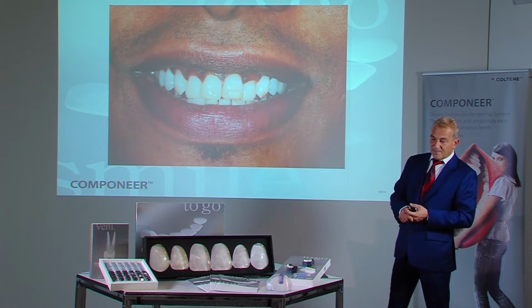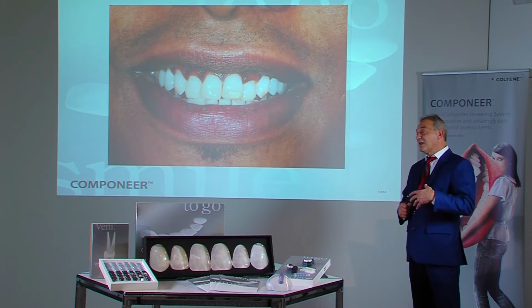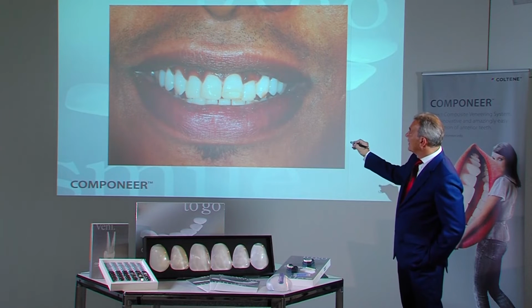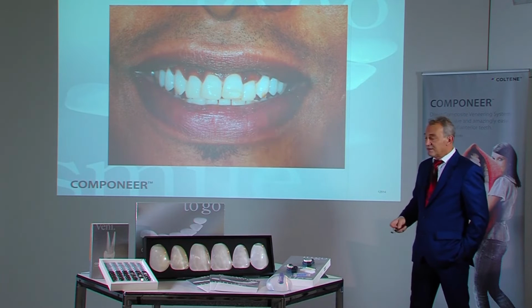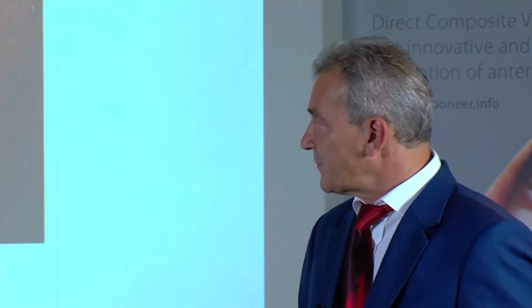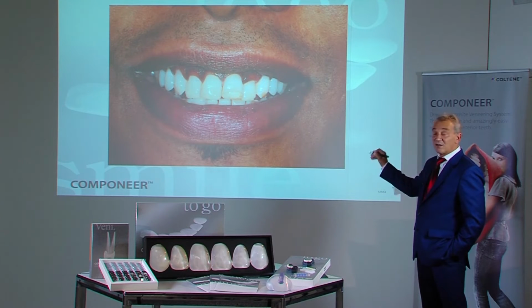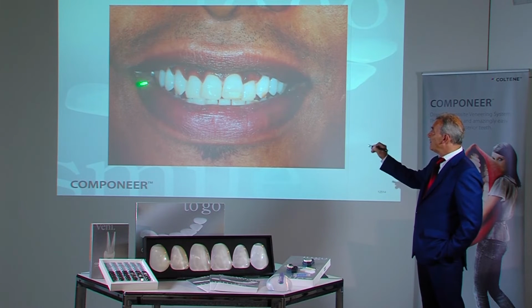This case demonstrates several problems at once. Strong pigmentation of the lip and the gingiva do not worry us. This just makes the teeth look brighter and whiter. However, we can see hypoplasias on several teeth, both in the maxilla and the mandible. Work has already been performed on these, and it has attempted to cover them with composite. But not 100% successfully in terms of aesthetics. We can also see incorrect axial angles of the teeth, and we have incorrect crown lengths to represent the lip profile.